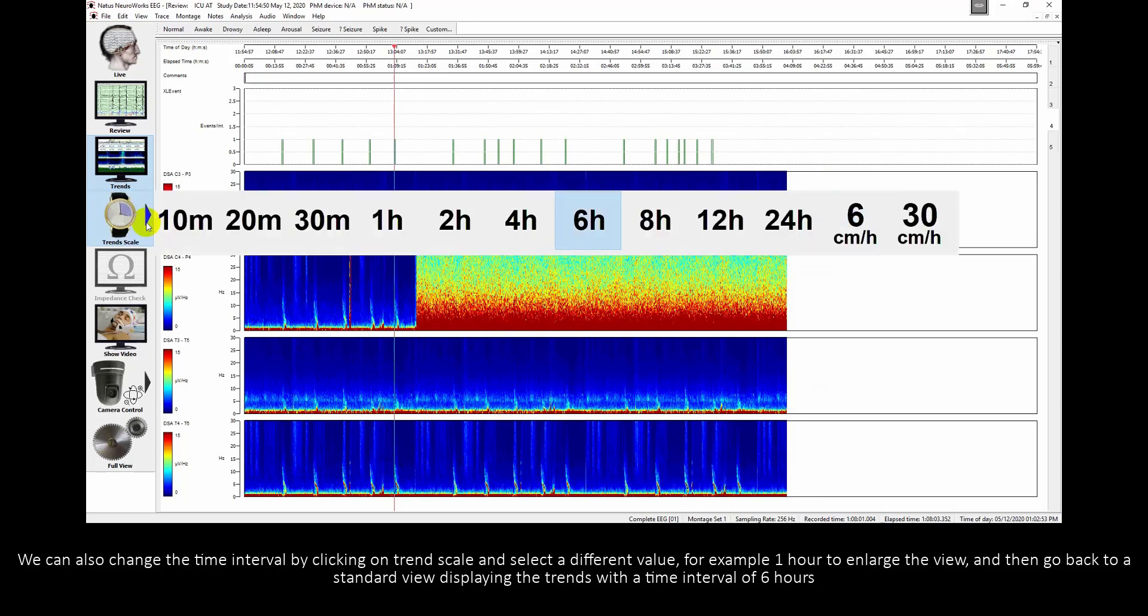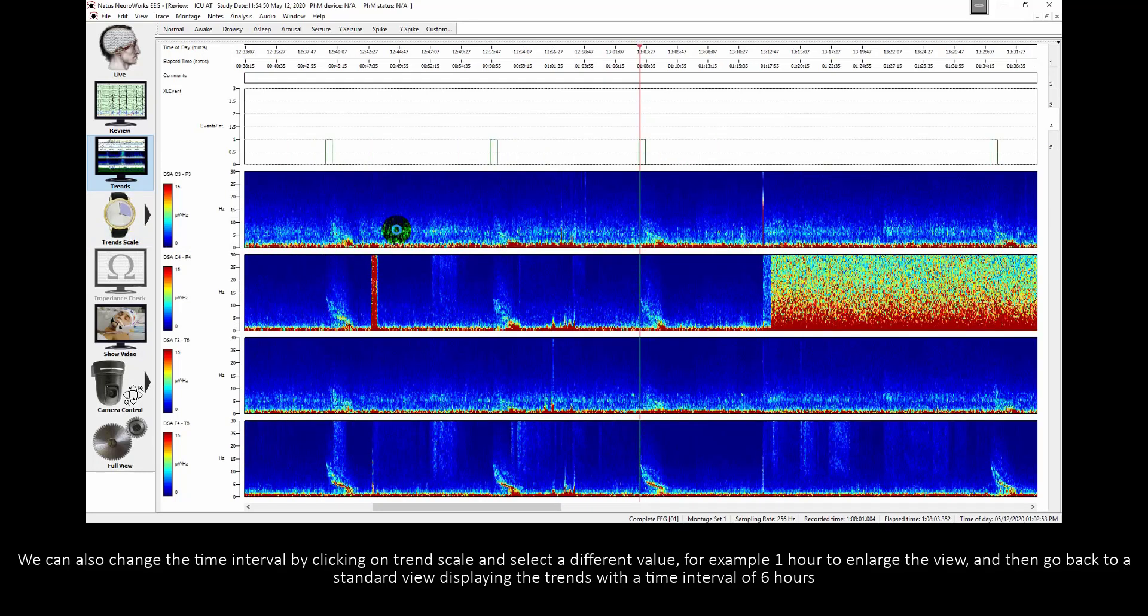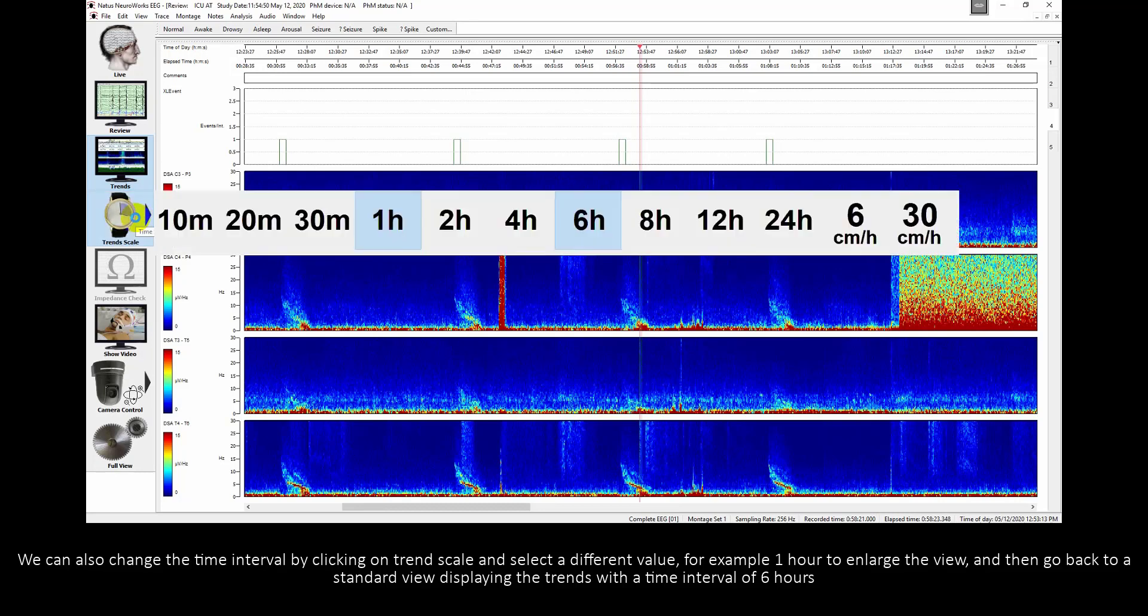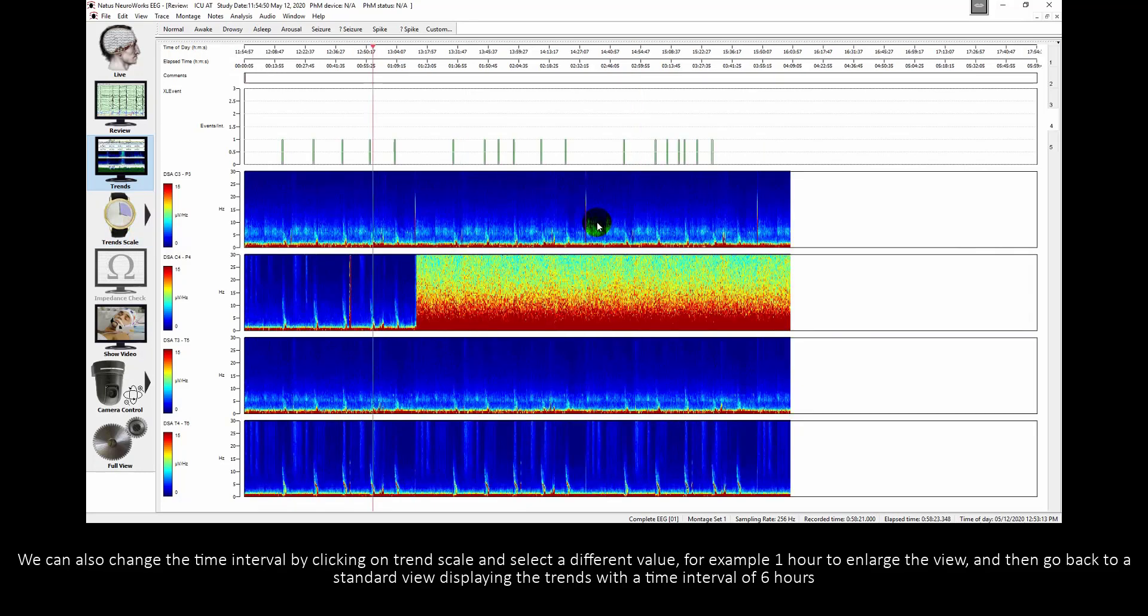We can also change the time interval by clicking on Trend Scale and select a different value. For example, one hour to enlarge the view, and then go back to a standard view displaying the trends with a time interval of 6 hours.